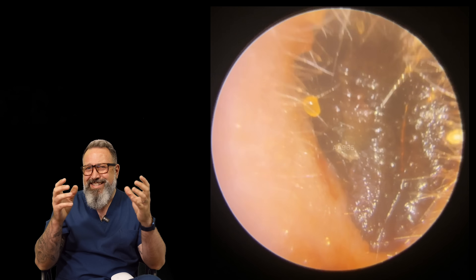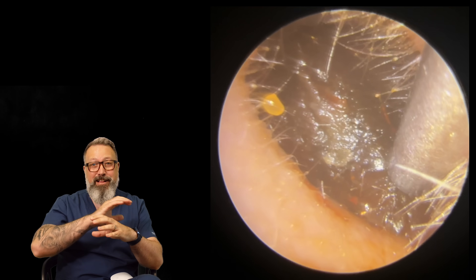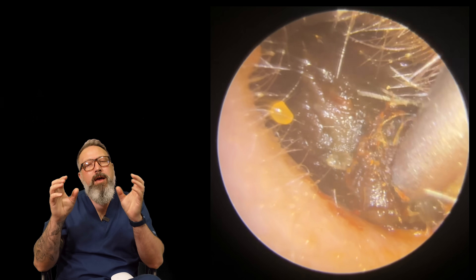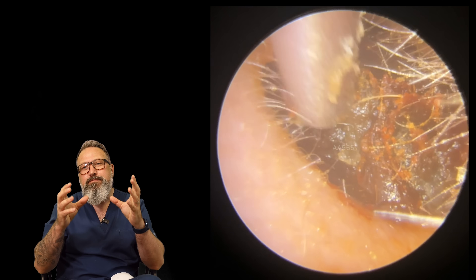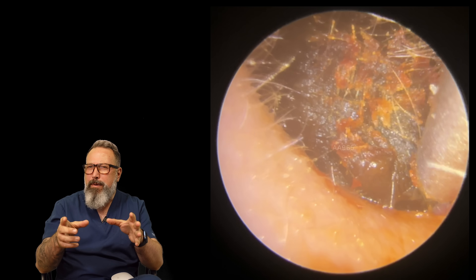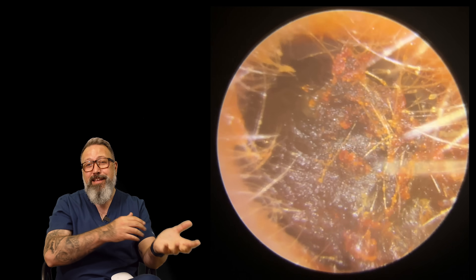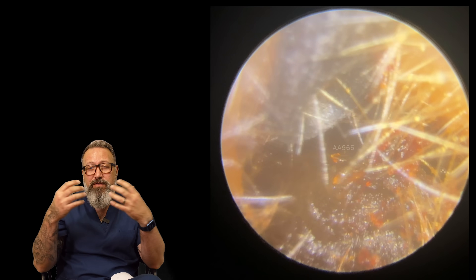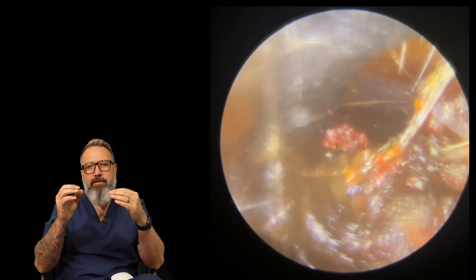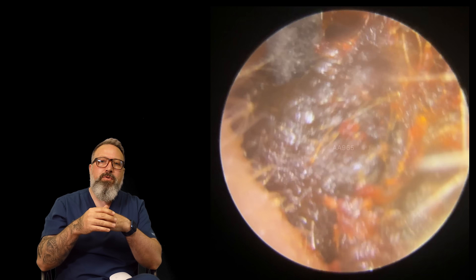Now look at this second ear canal - this is the chunky wax plug I was telling you about. Completely full, you cannot see around it at all. But the biggest difference here is that this wax is much much softer. The patient prepared this ear - why this one and not the other? Because they didn't realize they had a problem in the other ear, which is quite a common theme if there's a small gap somewhere and sound can still get through.